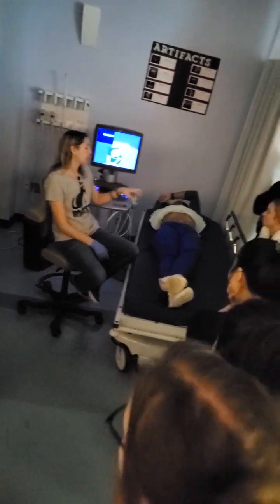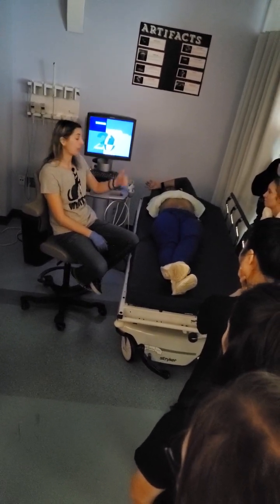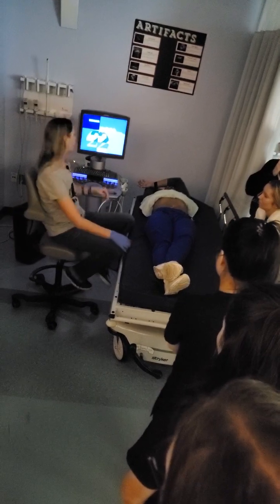So I usually do all my liver stuff, and then I do my gallbladder in supine, roll my patient, do my gallbladder in LLD, and that sets me up for my kidney scanning. So I have 180 degrees to scan my kidneys. We'll get into that with renal scanning here in a few weeks.